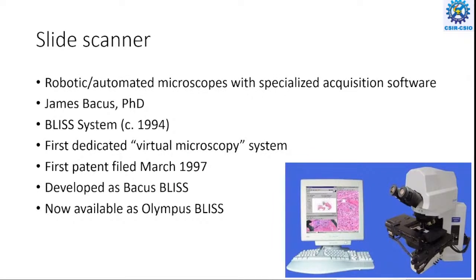What I have shown earlier was a single field of view of the microscope under one objective. But many times, the microscopic images we need to see for the assessment of any disease may or may not be available in a single field of view. So the pathologist needs to move the slide in the XY direction to see different fields of view and then find out if there is any abnormality. But he or she may lose some information because it is impossible to go across the slide at each and every location.